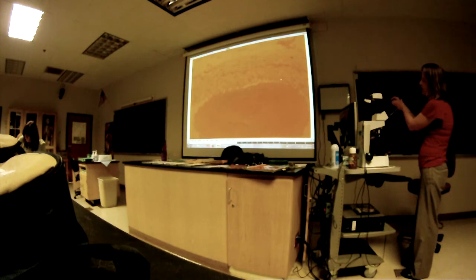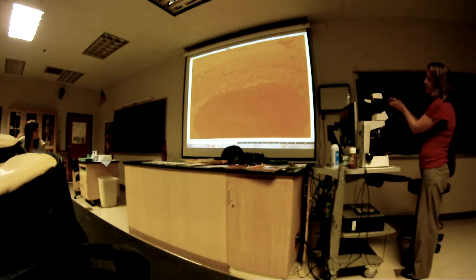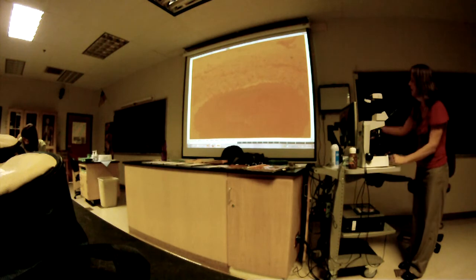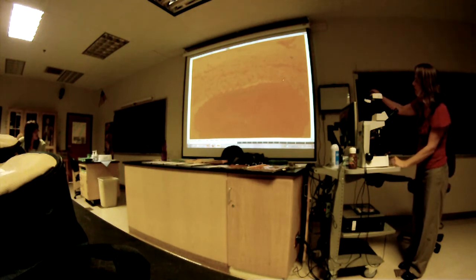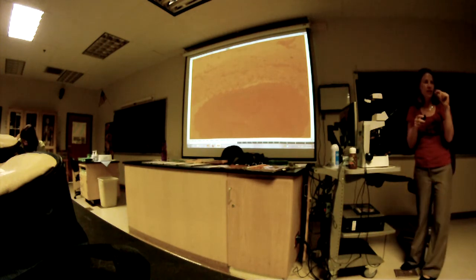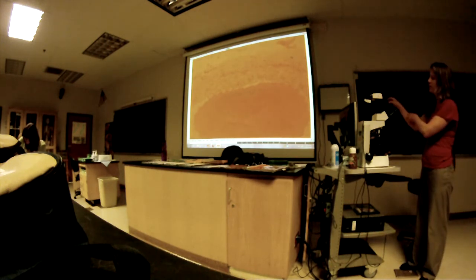So the intima layer, you basically see this kind of squiggly line that looks like a rubber band. Okay, that's part of it. That's not on your lab list, but that's called the internal elastic membrane. We'll go over it as part of lecture. That's part of the tunica intima. And then you can see the nuclei of the simple squamous endothelium in there. See, there's a scattering of nuclei here. So you have the endothelium, which is simple squamous lining, and then you have that elastic layer right there, that's squiggly. That's all part of the tunica intima. Those two things, endothelium and then that internal elastic membrane, which is not on your list.